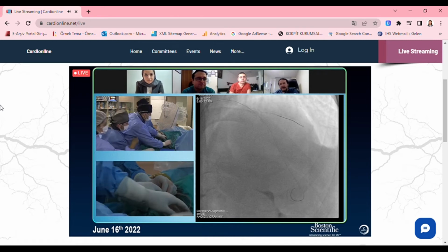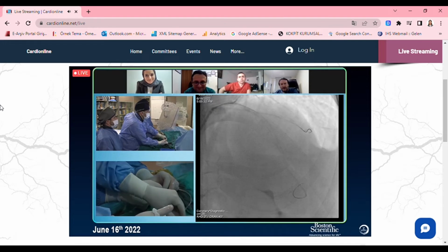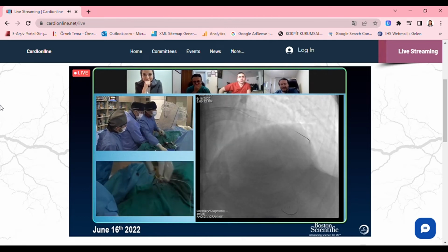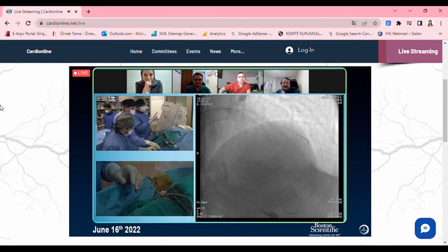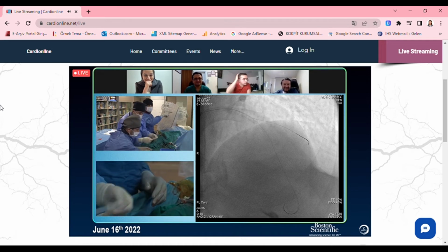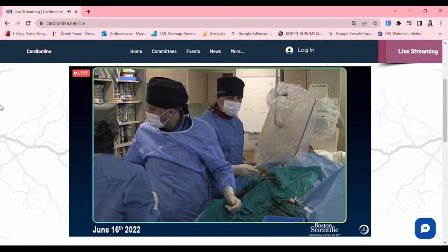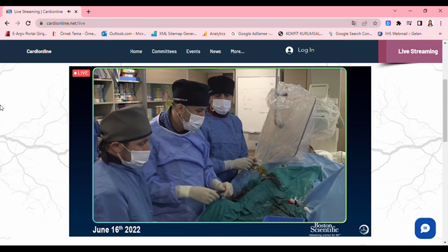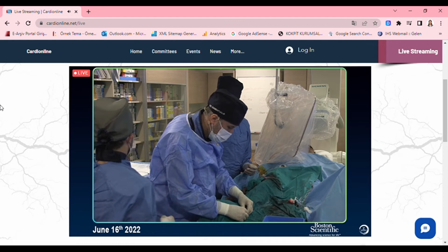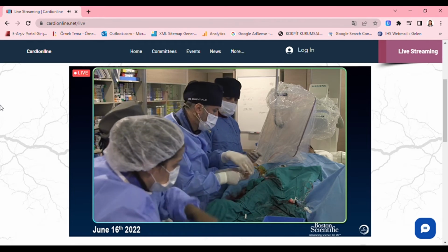So Şevket, this was so easy. I don't know why you are wondering. No fun at all. This was the easy one already. Let's do another one. Let's wire the first diagonal as well. Leave it. Elif, give him a Samurai. Don't let them work on Choice. No, it's okay, Choice is good. I'm not that rich, Şevket. But Elif is rich.